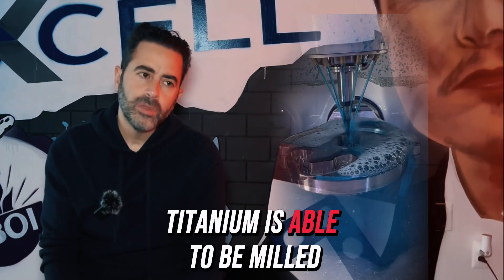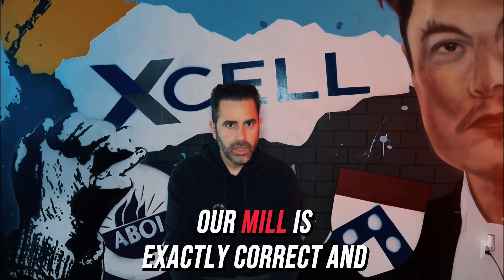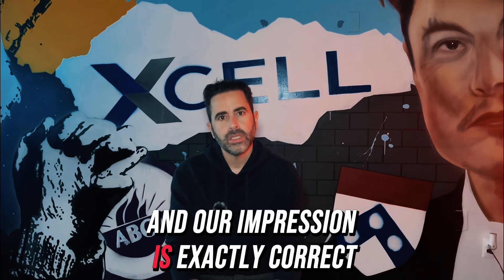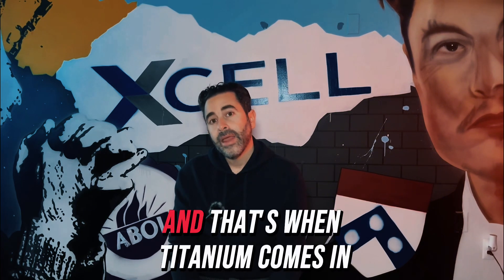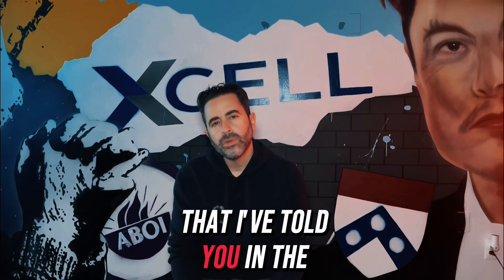Titanium is able to be milled at a one-to-one ratio. If our mill is exactly correct and calibrated, and our impression is exactly correct and calibrated, we will have a restoration that fits and is passive. That's when titanium becomes the right choice. But we still have the issue I mentioned at the beginning about titanium being difficult to manufacture.